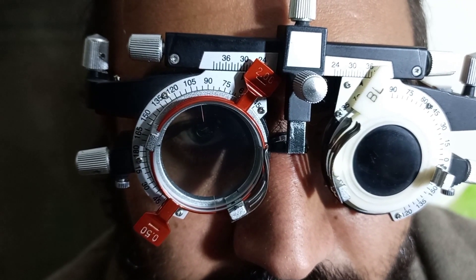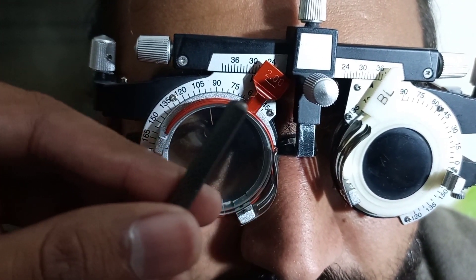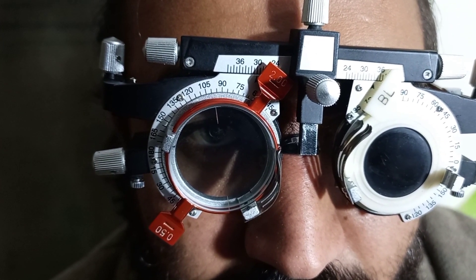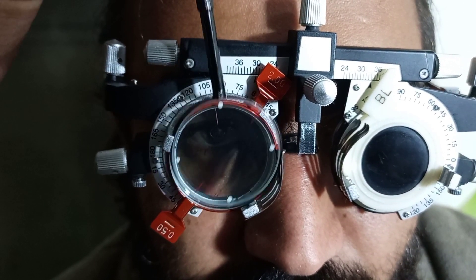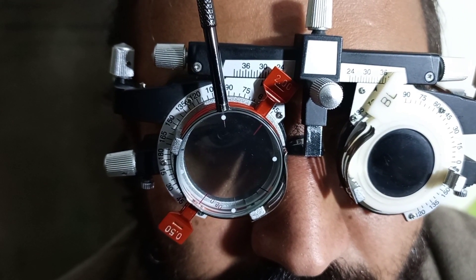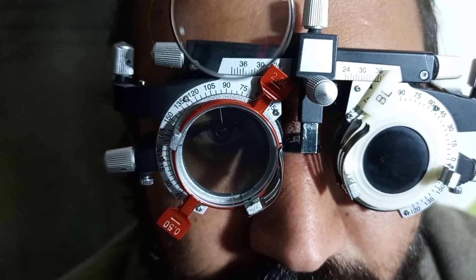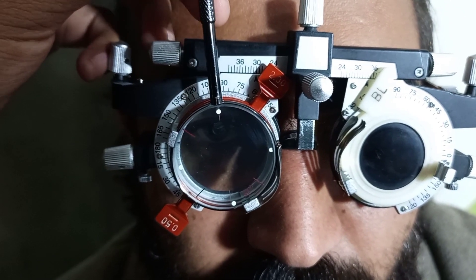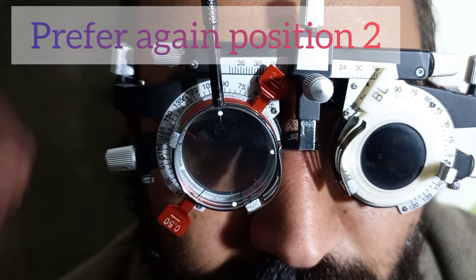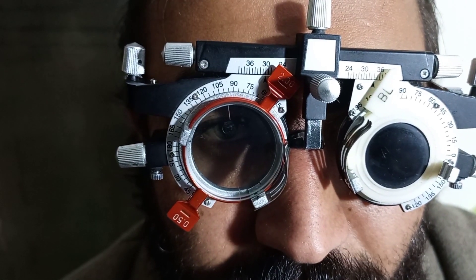Now again we have to align the handle of the Jackson Cross Cylinder with the axis of the trial cylinder. Our new axis is 95 degrees, so we align the handle at 95 degrees. We ask the patient: is the line clearer, darker, and sharper at position number one or position number two? The patient is preferring again position number two, when the minus line is aligning with 135 degrees.